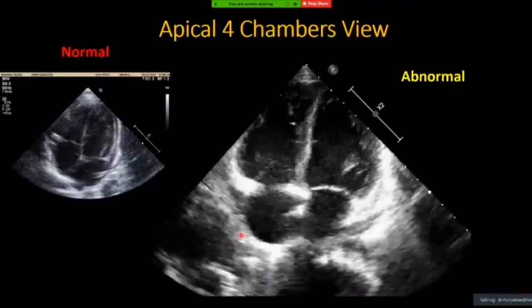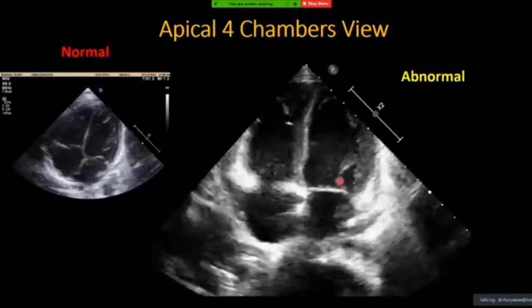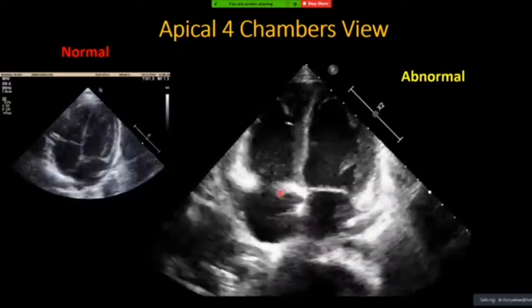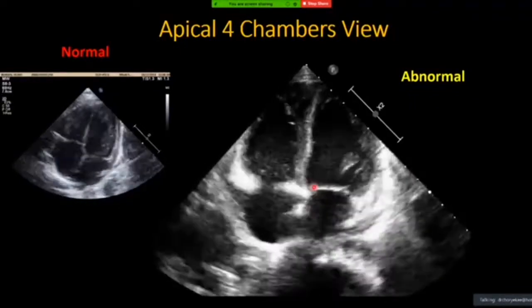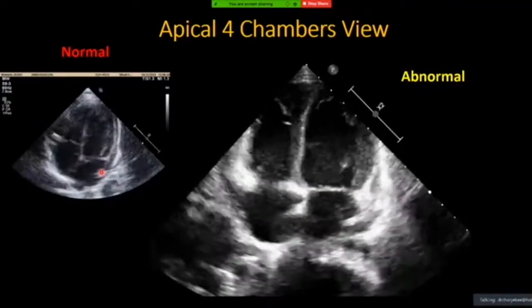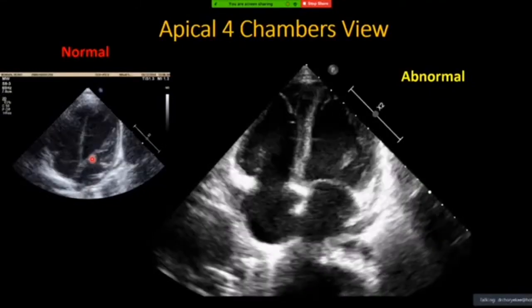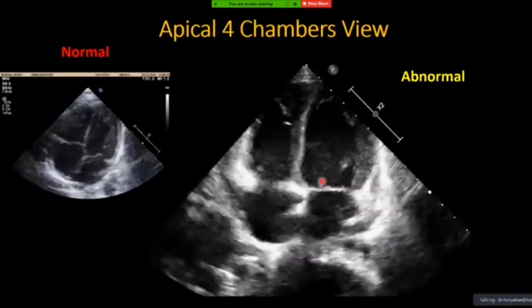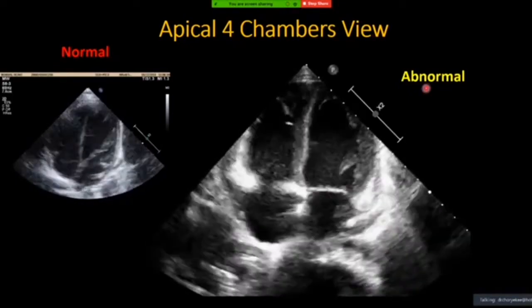So we look at chamber too filled, and then when you look at the valves, we see the mitral valve here, and the tricuspid valve here. As you could compare, the mitral valve did not open very happily as compared to this one. This one could open happily. This one could nearly touch the septal wall, although this attempted to, but not all. So it shows that there's impairment in contractility.